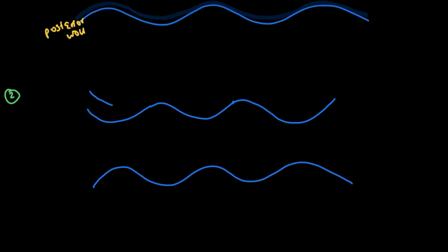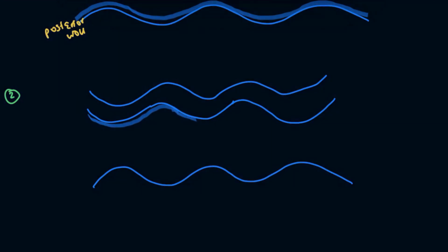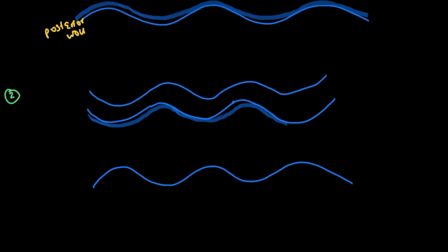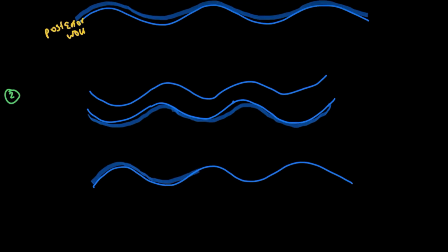Add in our RV for completion's sake up here, even though that's not the focus of this. Let's add a little bit of thickness for the left ventricular septum, and then also for the posterior wall of the left ventricle.